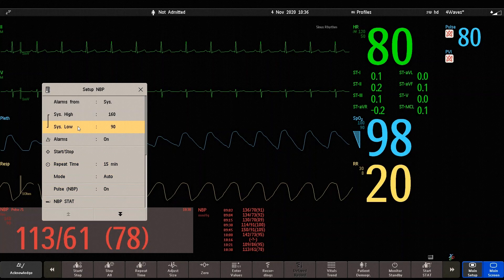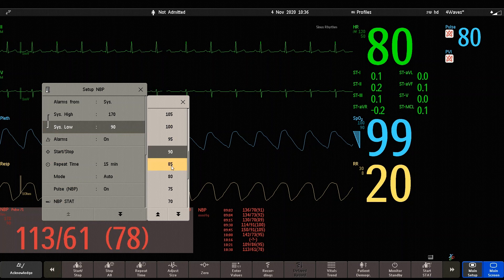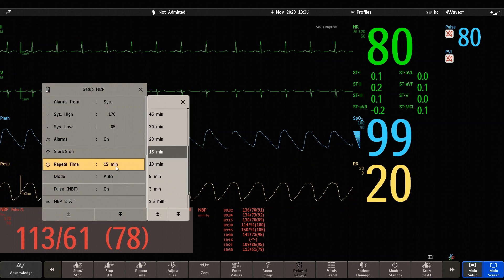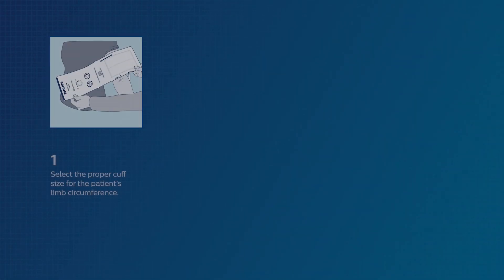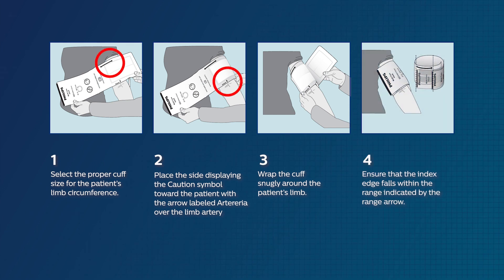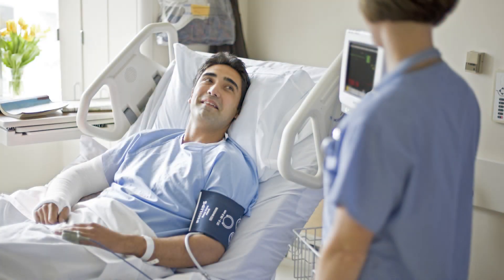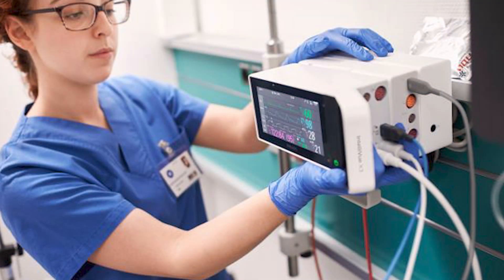Continue setup by setting appropriate alarm limits and repetitive measurements. Once bedside setup is complete, begin patient setup by choosing the appropriate cuff size for the patient's limb circumference and applying the cuff to the limb. Complete NIBP setup by ensuring the cuff is connected to the tubing and the tubing to the measurement server.